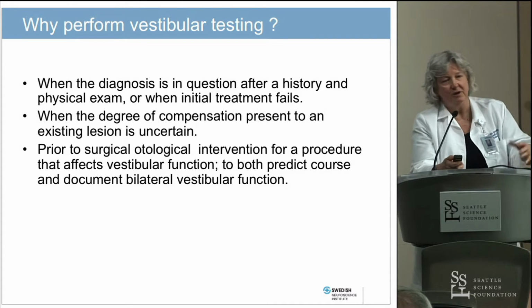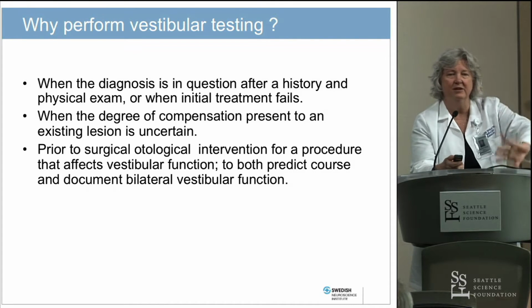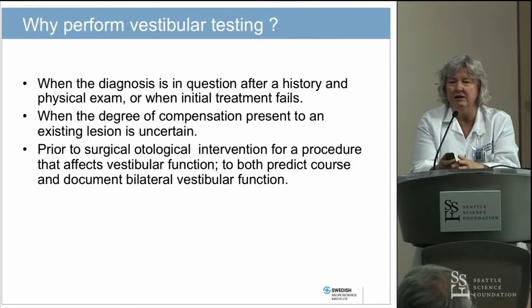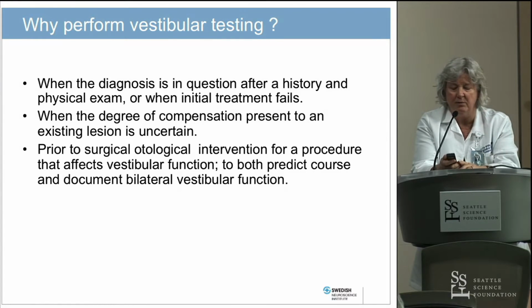What is that? Who does it? How do they get there? It's easier to set that up pre-surgery instead of post-surgery. So the testing will help you plan: is this a patient who really might need the surgery? Is this an only balanced ear? What does that mean and what do I have to be prepared for?